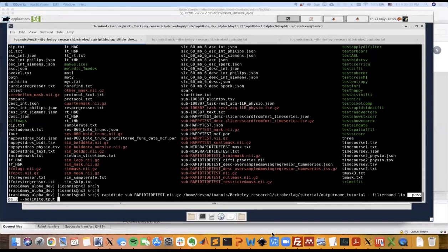What does that really mean? Well, the idea is that Riptide will create a new estimate of this initial global noise signal regressor by aligning all of the time courses in the data to bring the global signal in phase. Then a new regressor is going to be built by averaging these, and then the process continues.